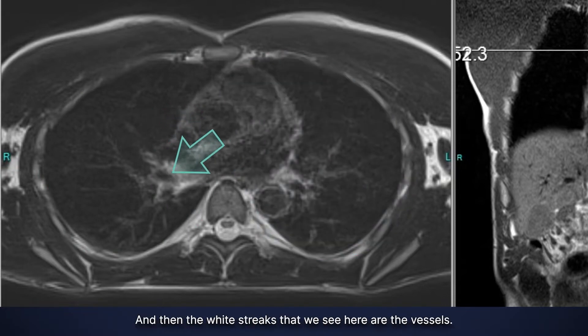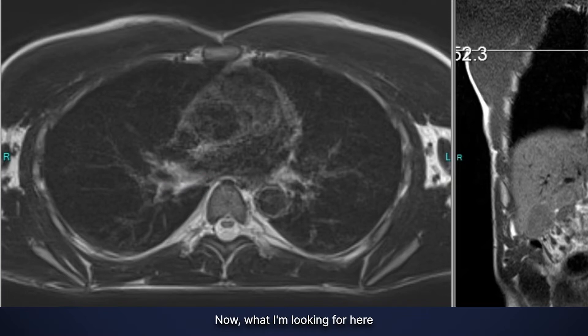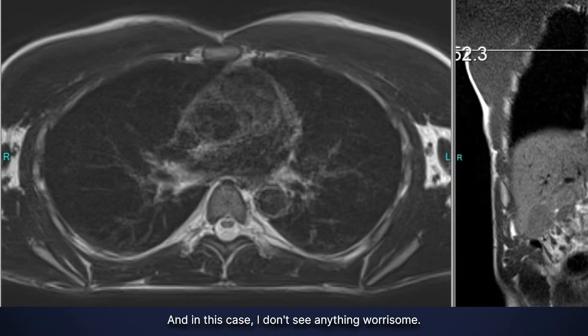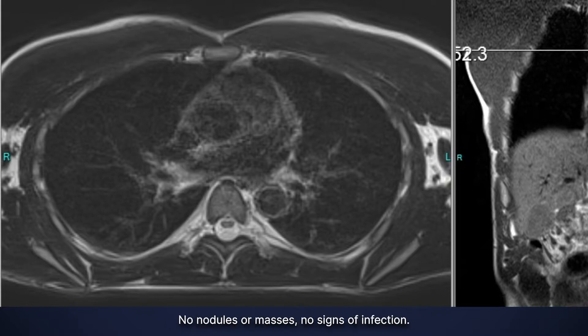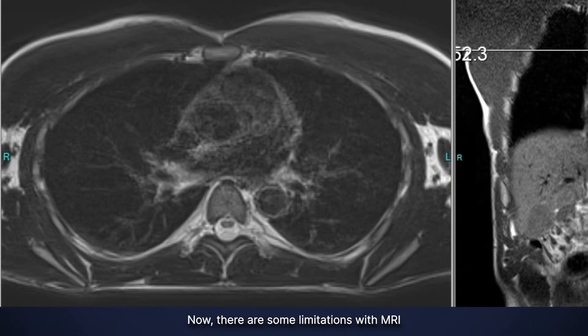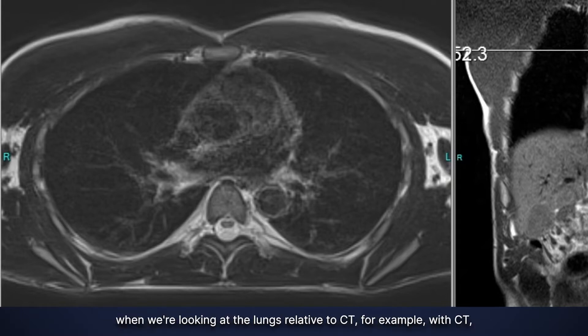The white streaks that we see here are the vessels. What I'm looking for are any kind of pulmonary nodules or masses. In this case I don't see anything worrisome — no nodules or masses, no signs of infection. These look normal by MRI.